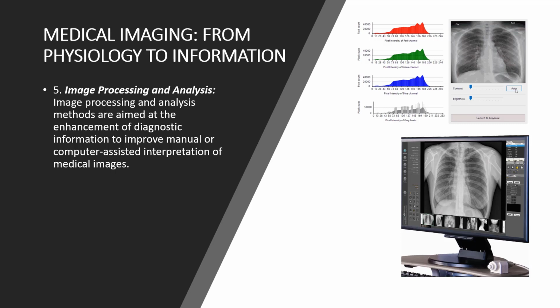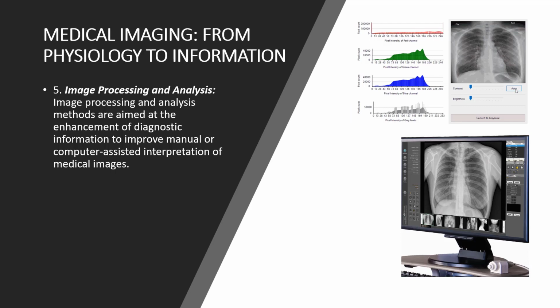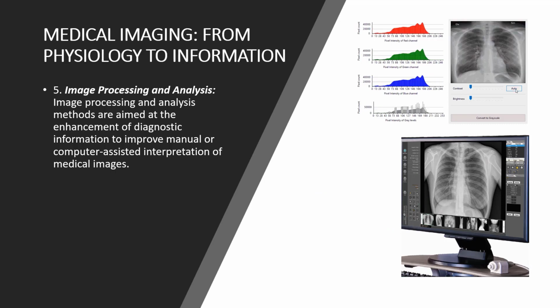We want to take a look at the grayscale down below. And on the grayscale down below, what we're looking at is the intensities that are recorded in what is called a histogram. It's nothing more than a two-dimensional graph of the intensities. We then choose the intensities that we want from this histogram based upon our input and create an image to view. Every image to be created has to have chosen parameters, and this is usually done automatically through our computer system based upon anatomical positioning and the AEC.